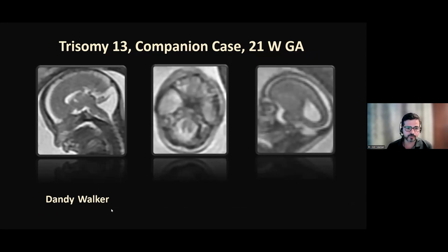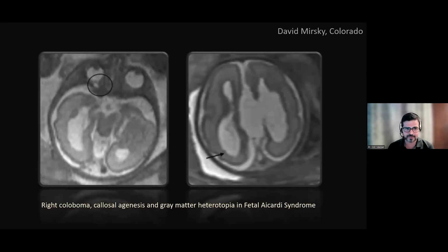phenomenology, I won't call it a malformation yet. Sometimes these can change over the course of the time duration that these children are scanned. This kid, of course, has frank anophthalmia, and then there is a callosal dysgenesis as well. And I have switched from calling things frankly agenesis of the corpus callosum to dysgenesis after having heard Dr. Taranath's talk so many times, where he talks about commissural dysgenesis or agenesis rather than an isolated ACC, basically.